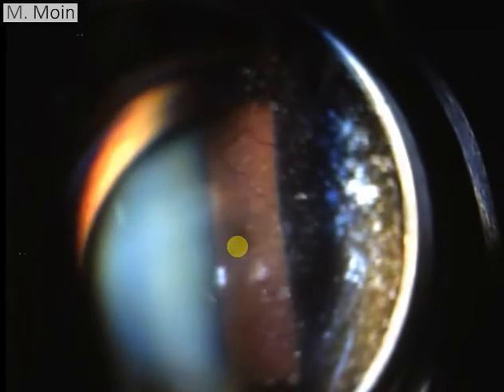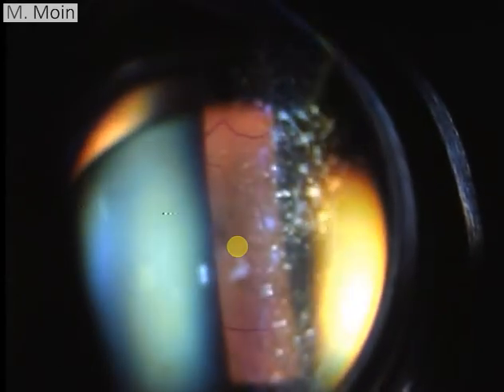The next thing we want to see is the periphery of the patient. This is the central area which we're trying to see. There is no scar of retinotomy, and this is the interesting area which we see over here. This is the buckle. It is important to recognize a buckle, and this is the area of the buckle which you need to see. This is a good buckle. The buckle height is wide, so this was a 7.5 mm buckle, or 277 tire, which has been sutured. So it is a 7.5 millimeter buckle which was there.